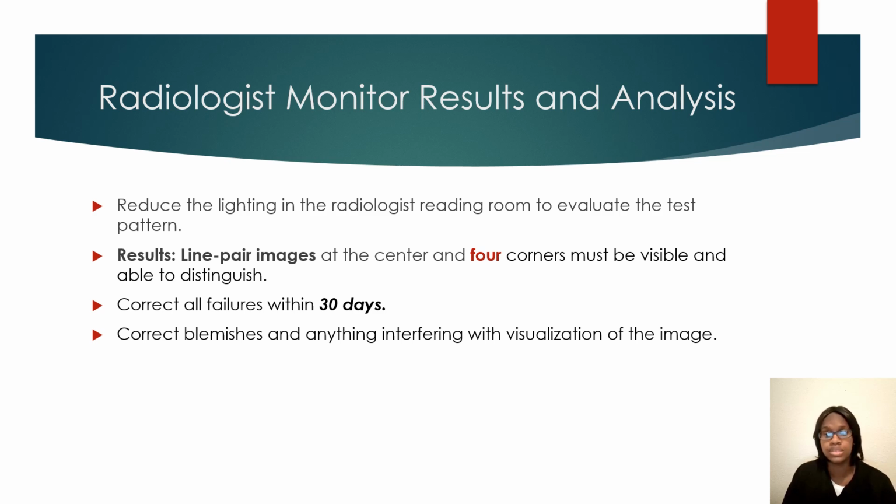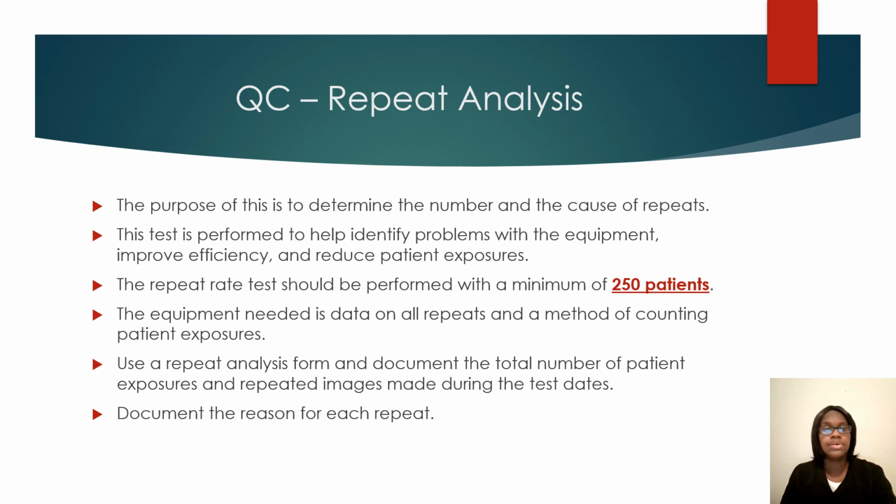Okay, for the QC repeat analysis, you want to perform this test with a minimum of 250 patients. This is going to be the information to determine why we are repeating so many mammograms. Is it due to positioning? Is it due to breathing instructions? Maybe we're not communicating with the patient well before we start the exam.